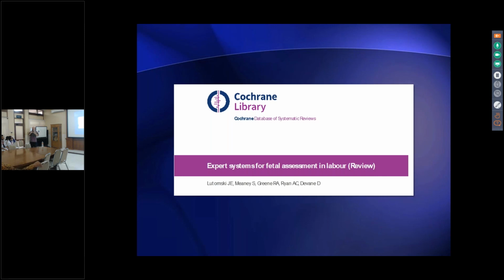Most will have a normal APGAR score. Most will not require resuscitation. So who was distressed? Was it the clinician or was it the baby? I've tried to encourage the use of the term, if you do a cesarean section, it's not for fetal distress. It's actually for abnormal fetal heart rate pattern, perhaps. Because the machine doesn't print out the distress. It prints out the contractions and the fetal heart rate, and you interpret it as such.